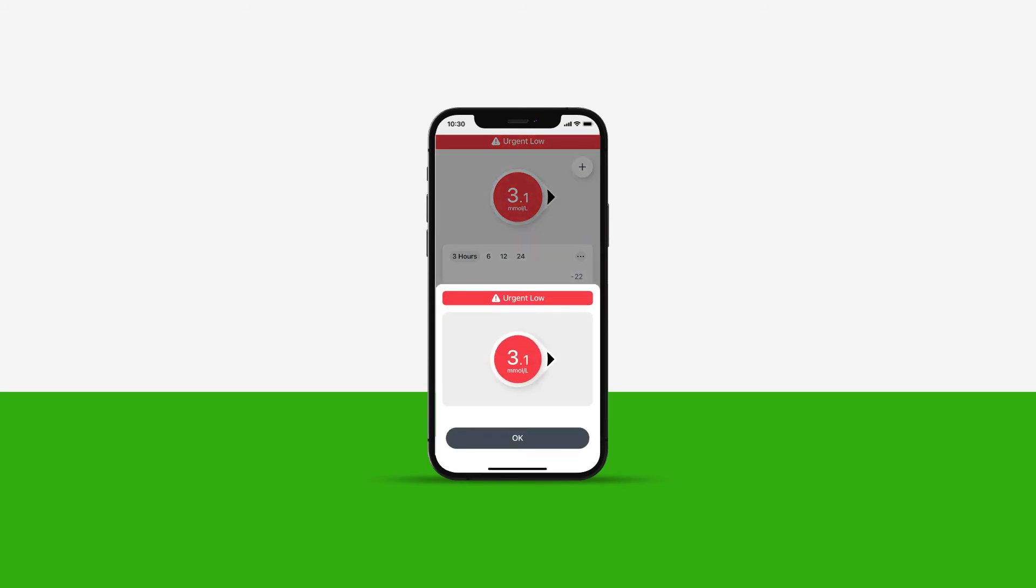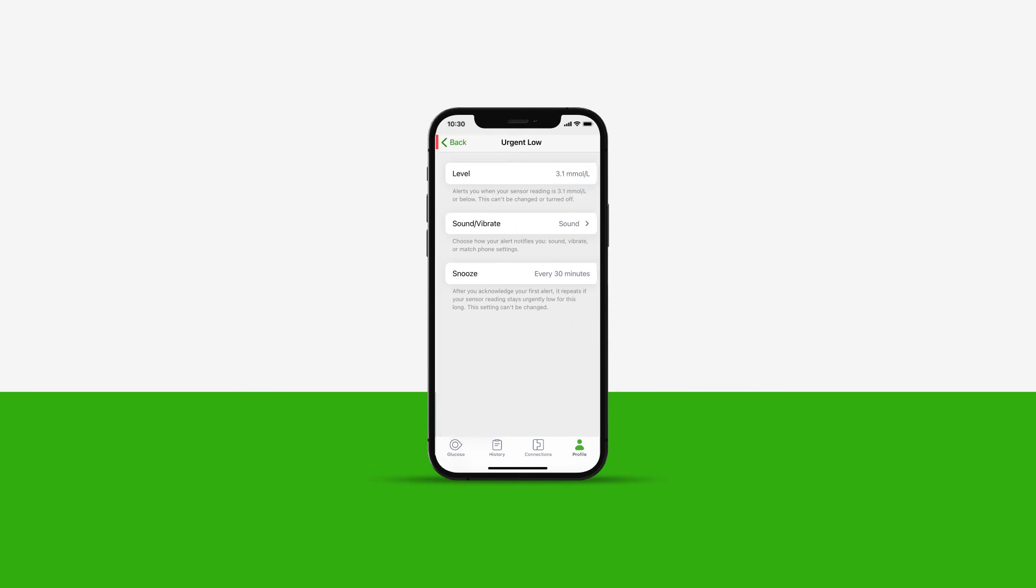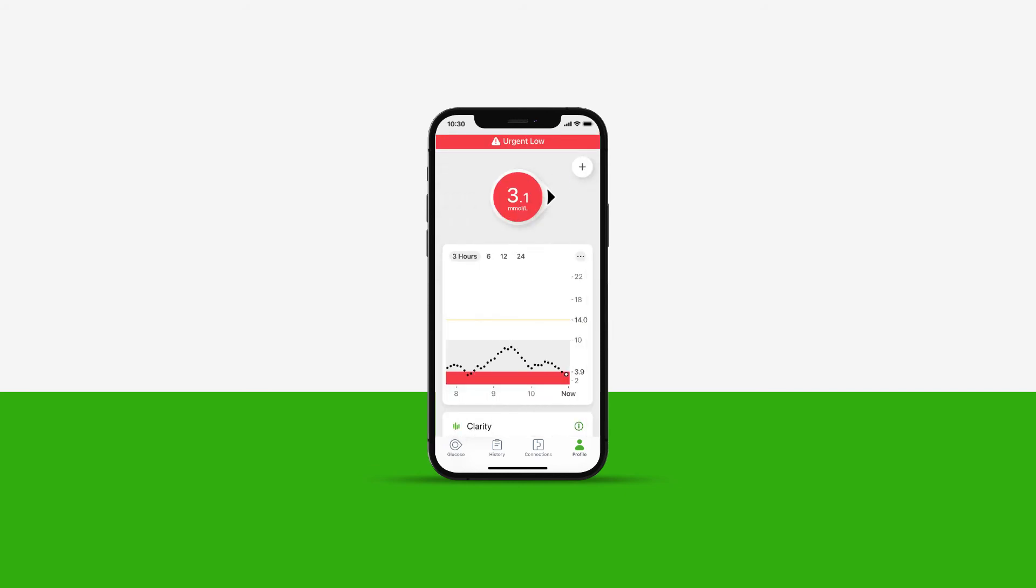Please note, your device will sound if you do not acknowledge your first alert when set to vibrate or whilst matching your phone settings. There is a fixed snooze alert. After you acknowledge your first alert, it repeats every 30 minutes if your sensor reading stays urgently low for this long. This setting can't be changed.